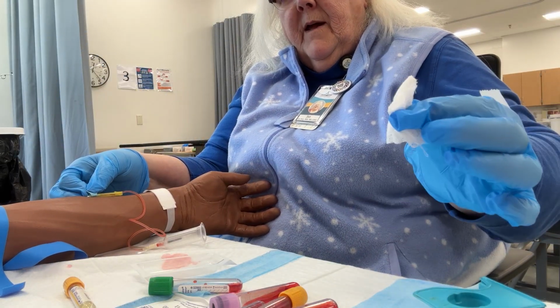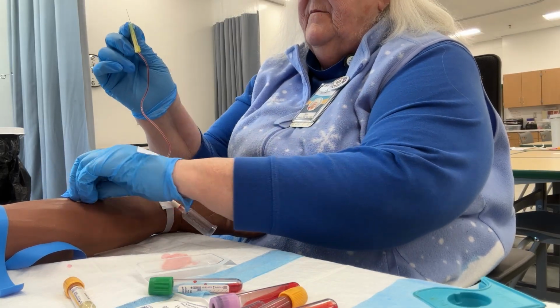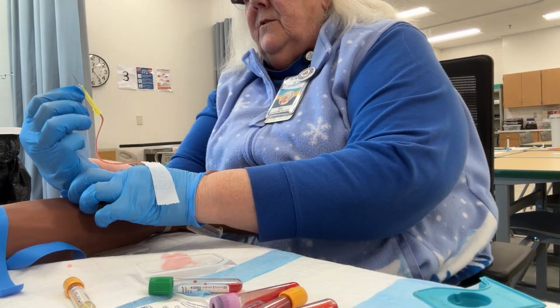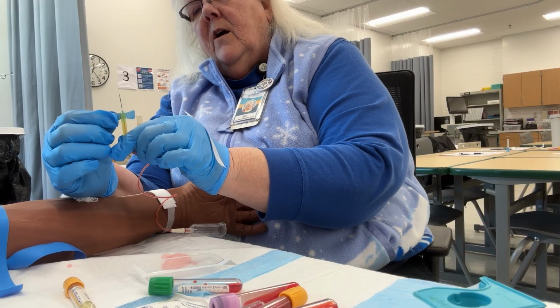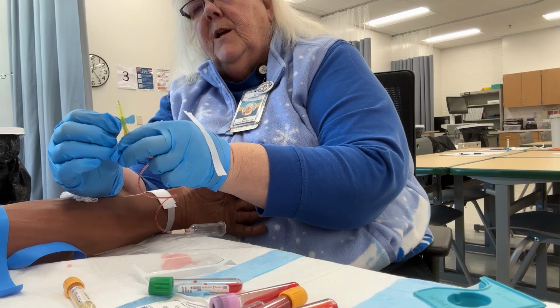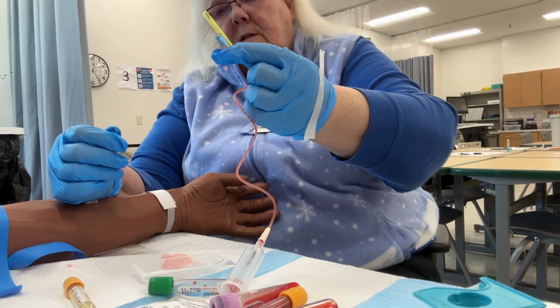Then I'm going to pick up my gauze, pull my needle straight back. Then I'm going to ask my patient to hold it. This is the way I'm teaching you guys to do it. I can do it one-handed like this. You're going to open the wings. If you hold one wing, pull down on the wing and push up with the yellow. That is your needle securement device so that nobody will get poked, okay?